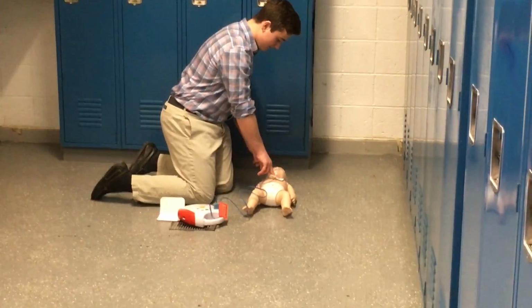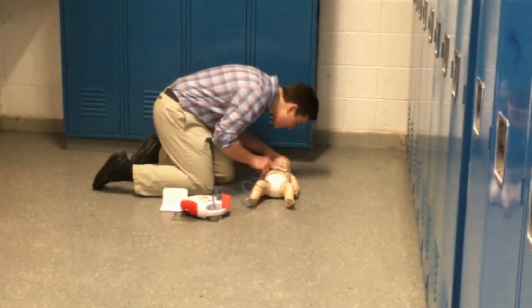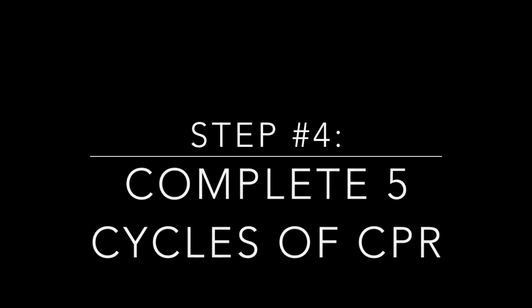Now, as you heard there, the AED directed Mr. Mazzomo to complete 5 cycles of CPR, and he would obviously do so with 2 rescue breaths and 30 chest compressions.